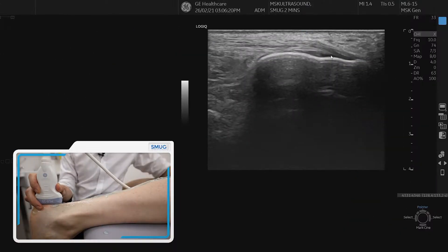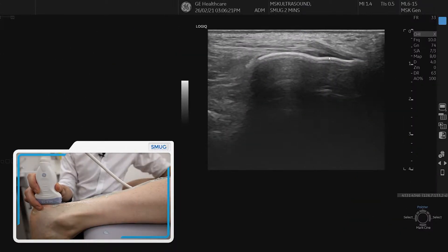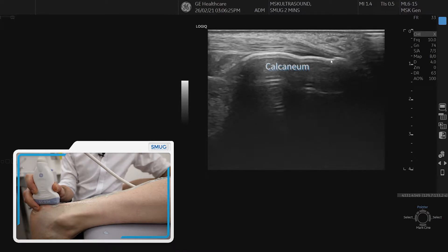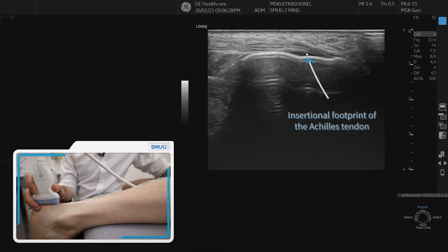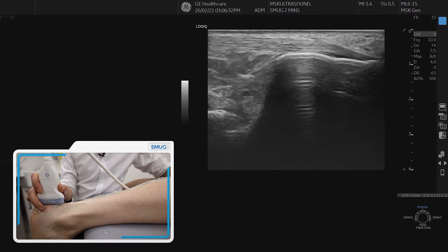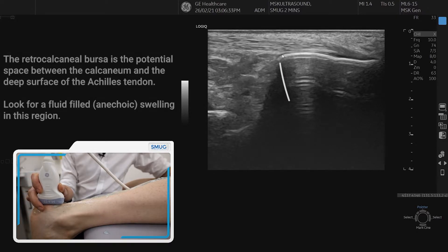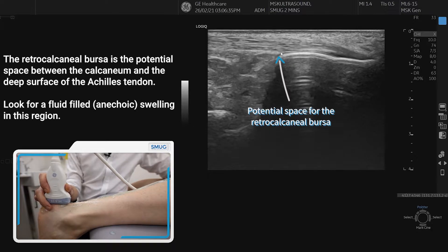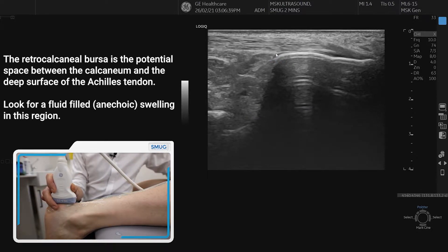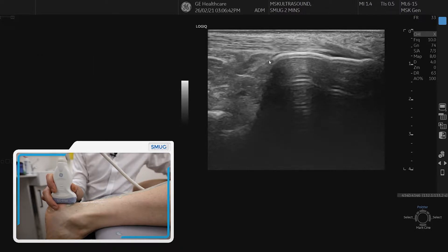To assess the Achilles and the calf complex we're going to start on the distal aspect of the calcaneum, where we can see the footprint of the Achilles tendon where it attaches. As we move more proximally we're going to look carefully between the bone — the calcaneal shelf — and the undersurface of the Achilles to look for any fluid, which would be anechoic, indicating a retrocalcaneal bursitis.